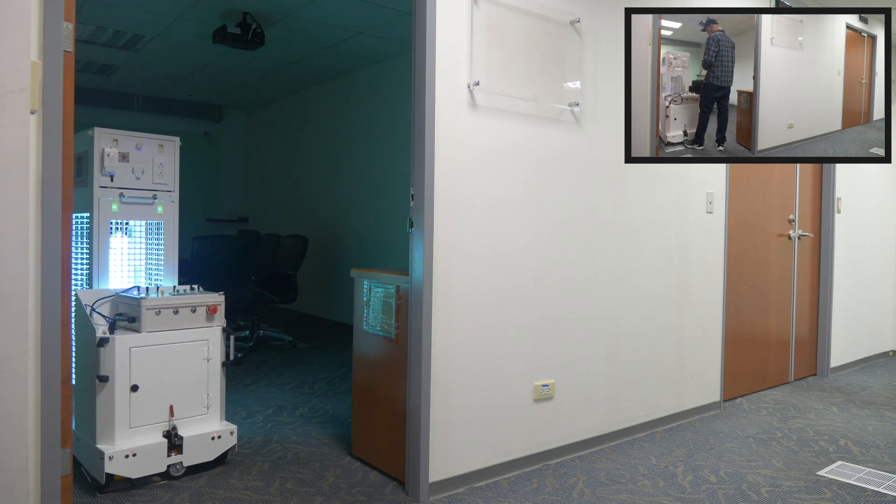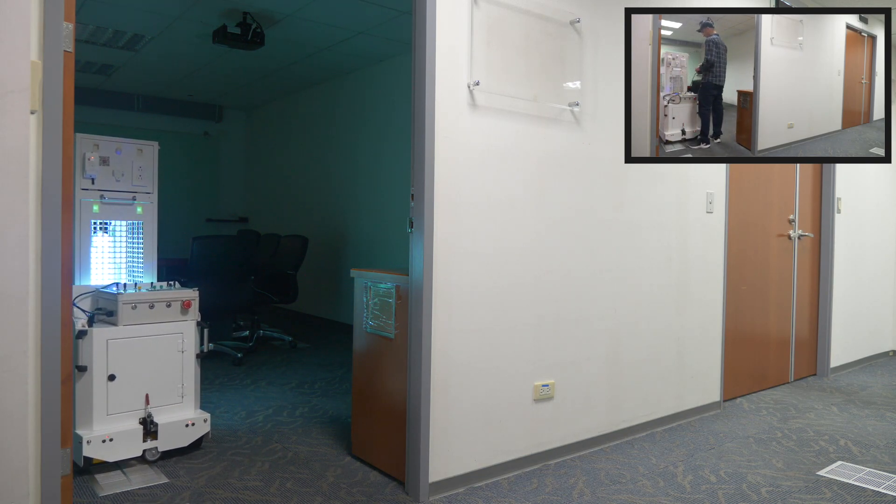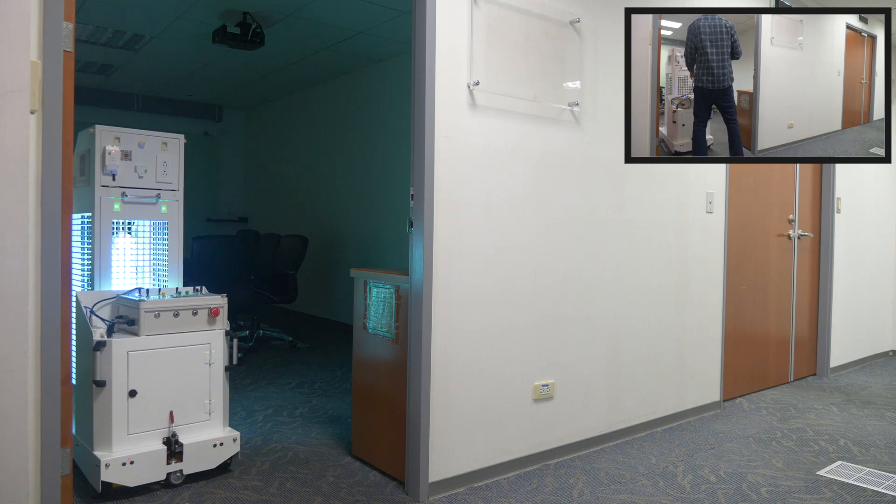Trainers can instruct the robot to stop at any point for radiation. The robot will learn the location and radiate the room based on the delay set up by users in advance.